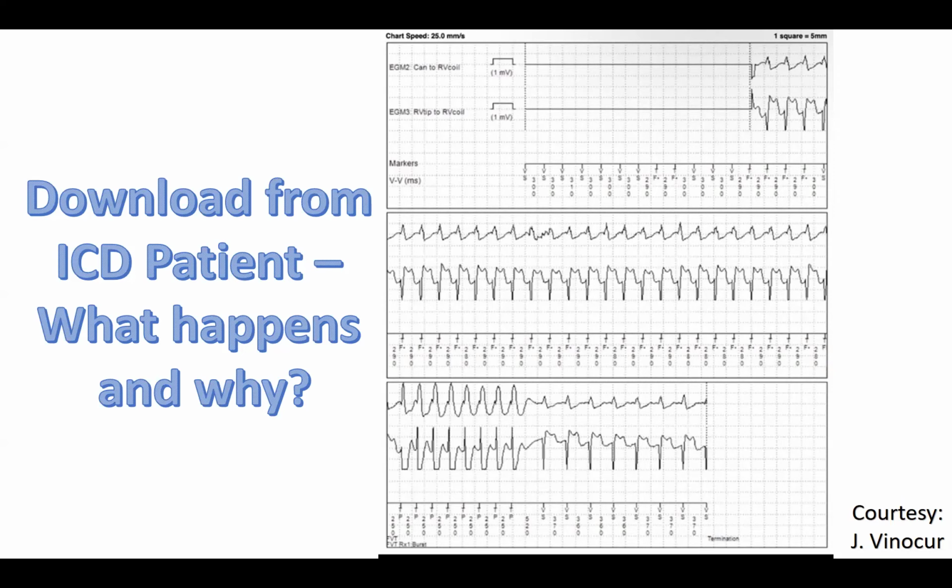The other issue was that defibrillators at that time didn't have as much power. So today, a standard defibrillator delivers about 36 to 38 joules. Oftentimes you'll see 40 joules, but that's what's stored in the device. But 36 joules, 38 joules is a high amount of energy for an internal defibrillator. In the prior era, there were devices that delivered that much energy, but they were special devices. They would call them high energy boxes.